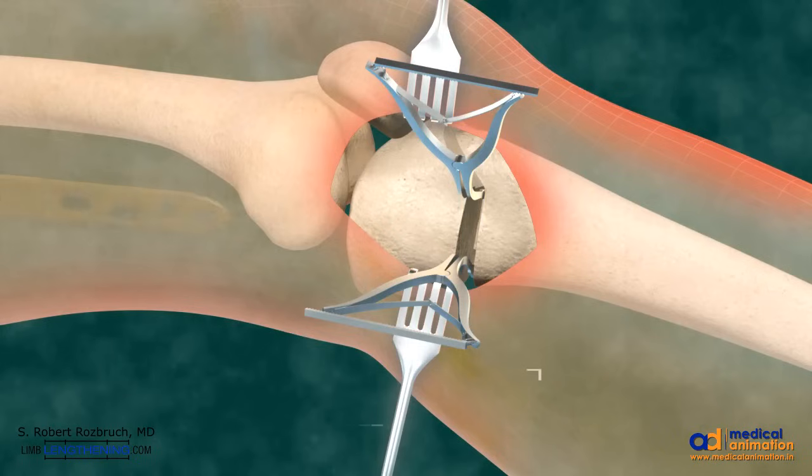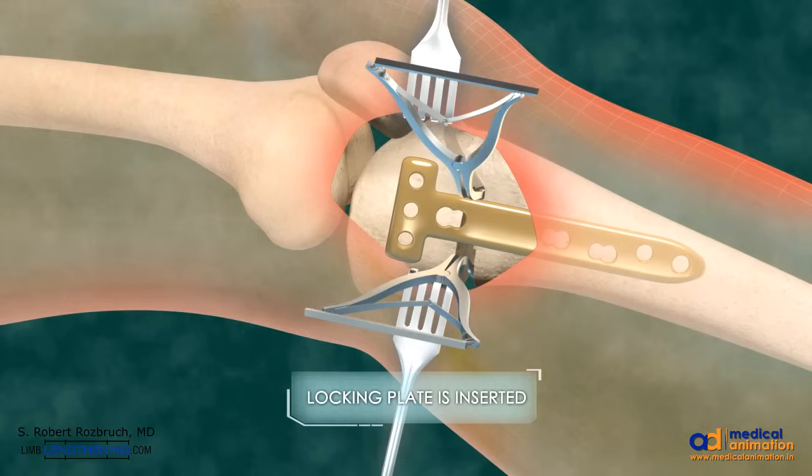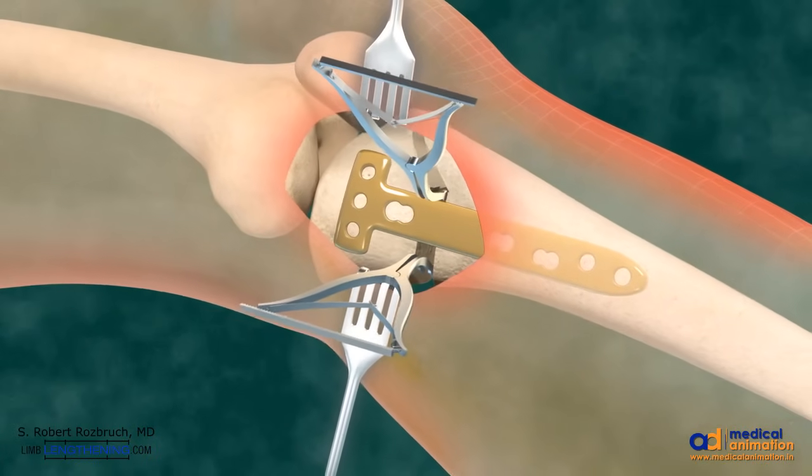The opening wedge is maintained with the laminar spreaders and a locking plate is then inserted. It can be slid under the skin so as to avoid a large incision.